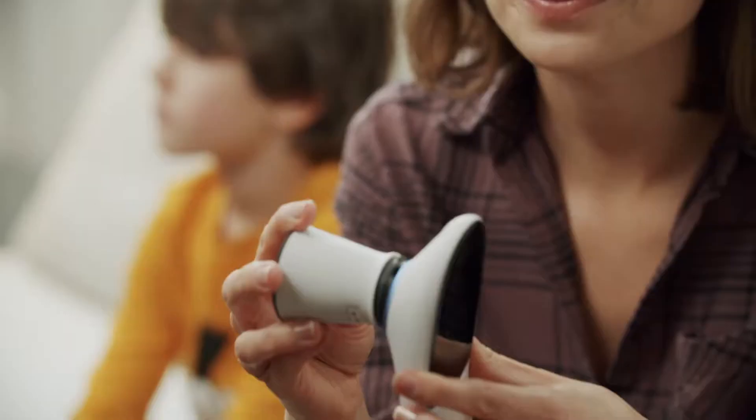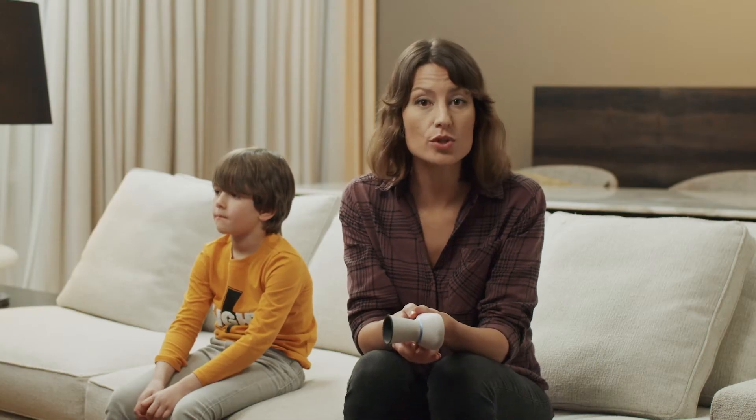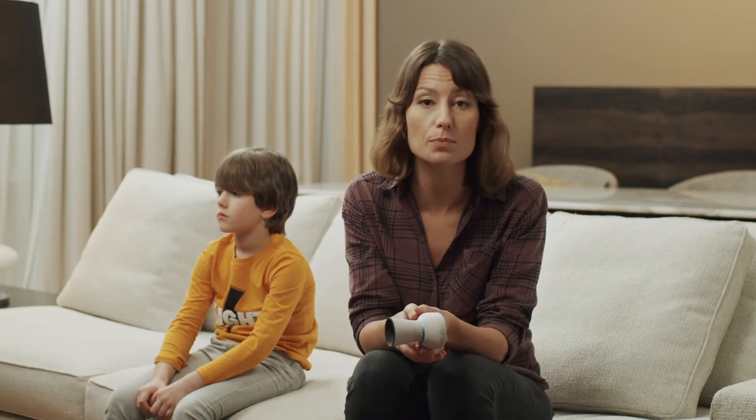Attach the derm hood. Place the edge of the module so that it is in direct contact with the skin. However, do not press the module too strongly against the skin as it may cause bulging.